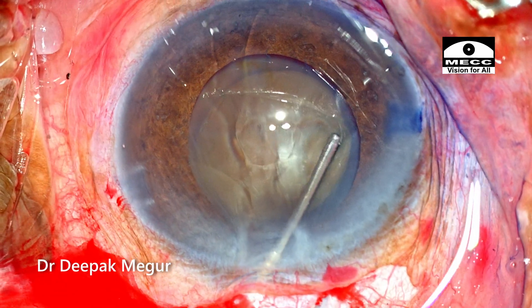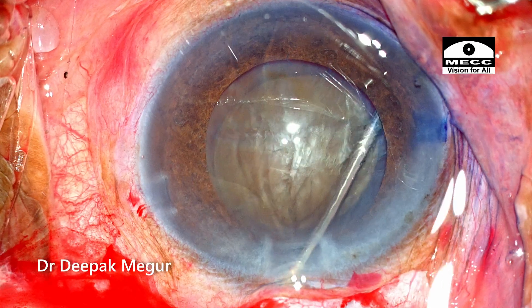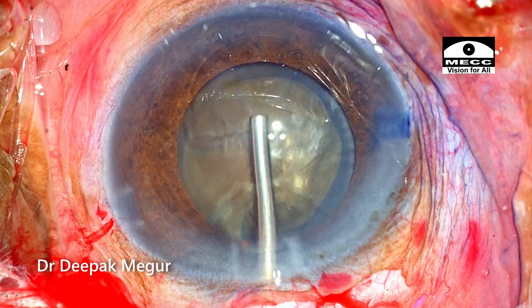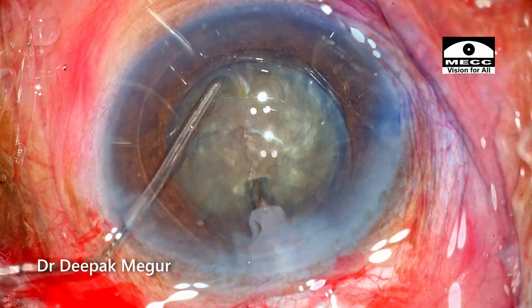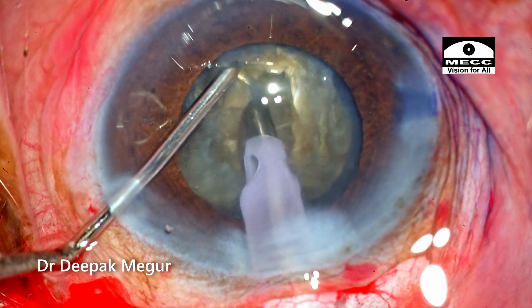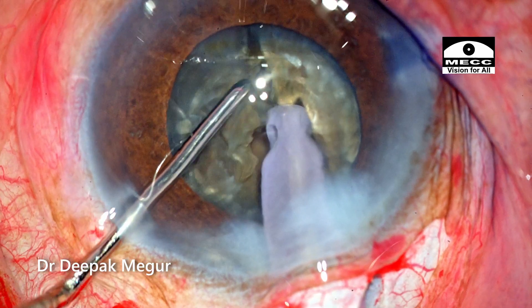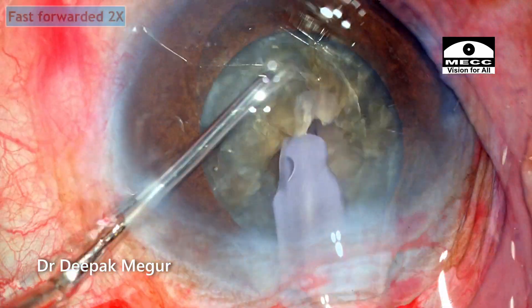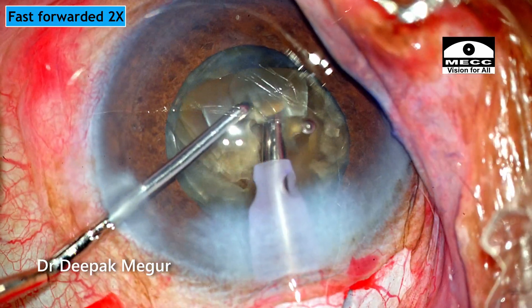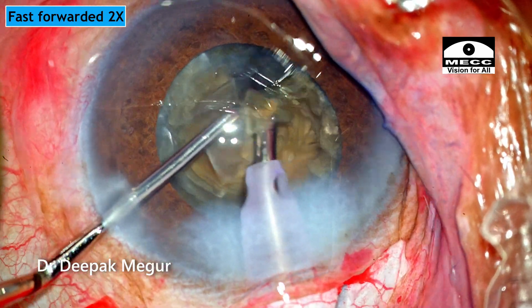I'm expecting weaker zonules in this patient because of pseudo-exfoliation, and hence cortical cleaving hydrodissection becomes a very important step. I'm using dispersive OVD to protect the endothelium. I create a small initial trench to get access to the core of the nucleus, then bury the phaco tip and perform vertical chop. All standard prescribed protocols are followed to avoid turbulence, and the lens fragments are aspirated in a very controlled manner.